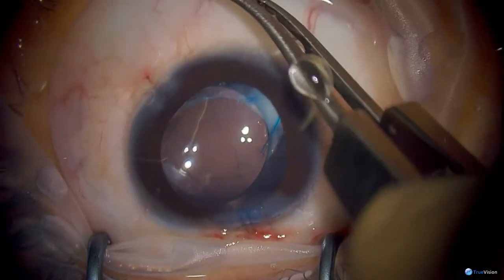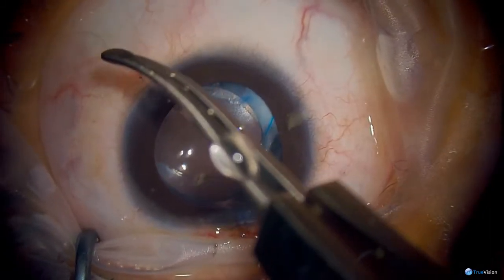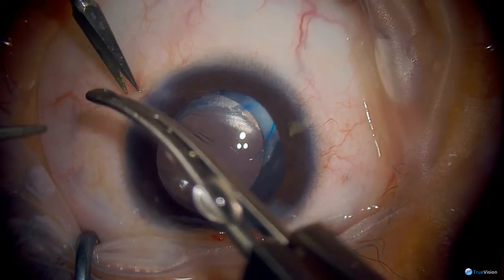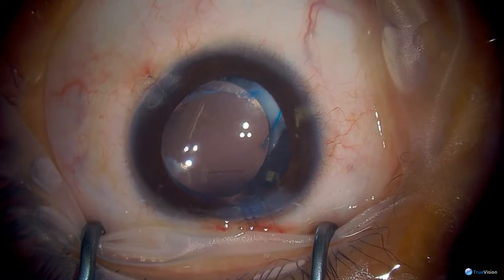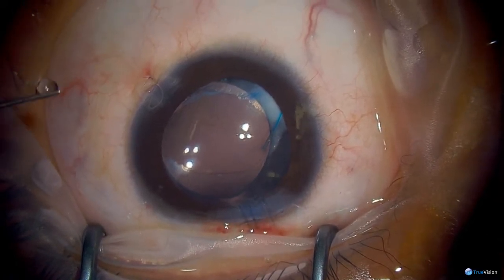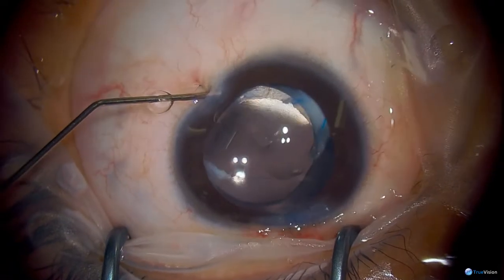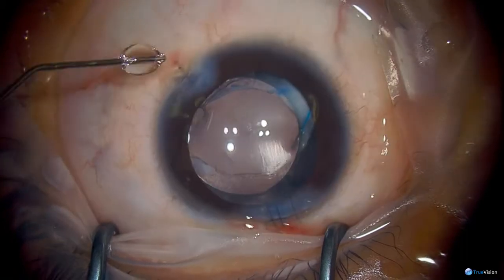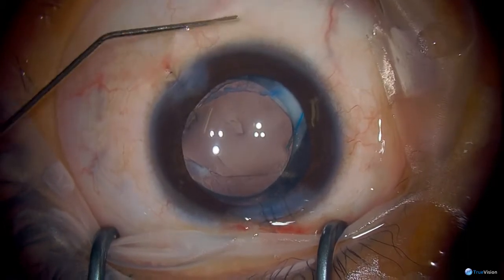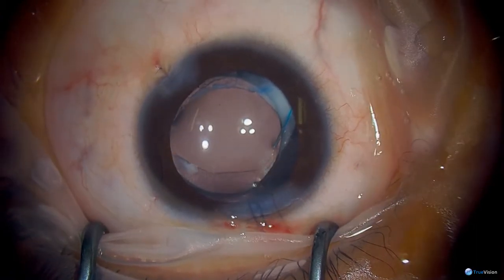If you don't leave any viscoelastic in, your IOP won't go up. And the pressure hasn't remained low in this eye. So we had a little bit of blood. I don't know if you saw that from the iris earlier. So it's not going to bleed now because we haven't let the pressure in the eye go down. And if there's no viscoelastic, the pressure shouldn't go up. So I don't routinely put them on, like Miochol or anything. We don't really need to do that there.